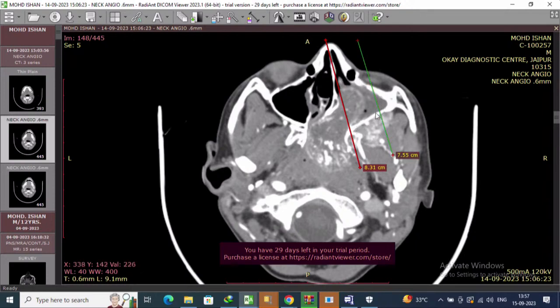We'll remove this posterior wall and look at the tumor behind. Whatever tumor is lateral to it, we'll pull it. This tumor is progressing, it doesn't take attachment at the progressing head, so it prolapses in the free area. Infratemporal fossa is a relatively area with less resistance, and it prolapses in the infratemporal fossa. And similarly, we can pull it out inside.